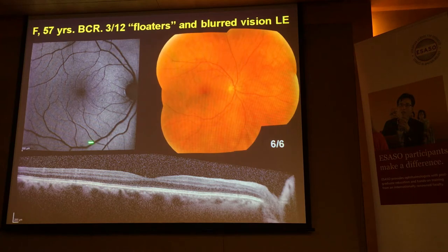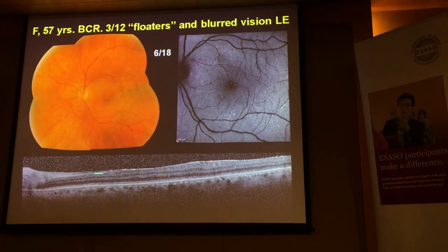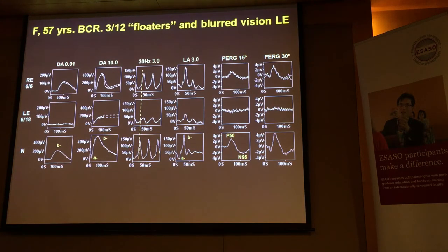Now, this is a patient with a normal looking right eye, who presented with blurred vision in the left eye. The right eye images beautifully, autofluoresces beautifully. Left eye, diffuse retinal edema, some focal changes, and some speckled hyperfluorescence within the arcade. And when we do the electrophysiology, the left eye, which is the symptomatic eye, shows no rod-specific ERG, bright flash ERG down. The asymptomatic right eye also shows a delay in the flicker. So there's asymptomatic dysfunction occurring in the right eye, which we're picking up in the electrophysiology. There's a big delay in the left eye, and it continues with no detectable pattern ERG.